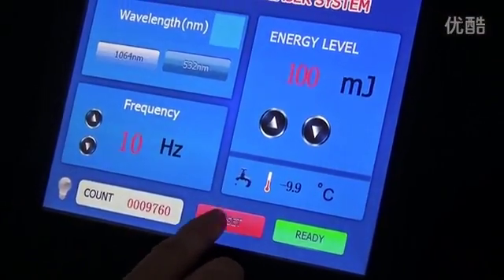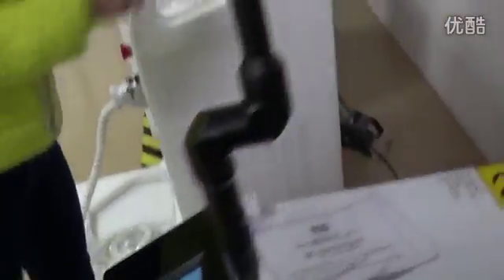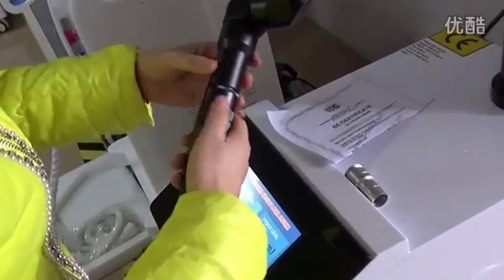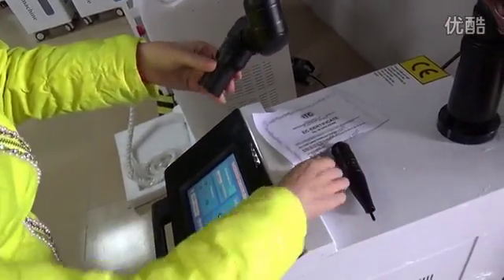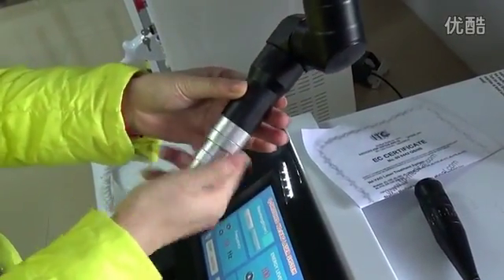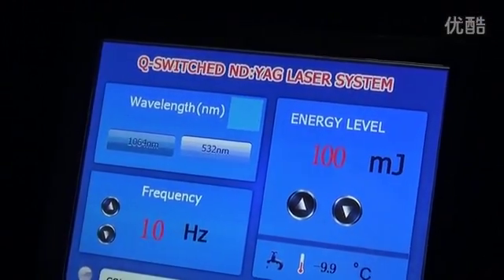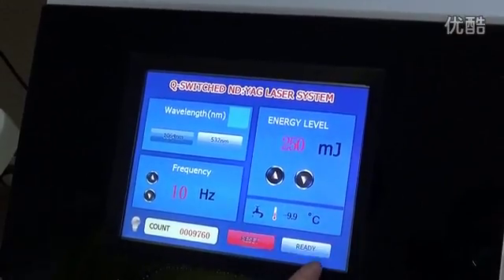After the treatment, press reset. You can also take out this head. After this picture disappears, then you can press reset and it's ready.